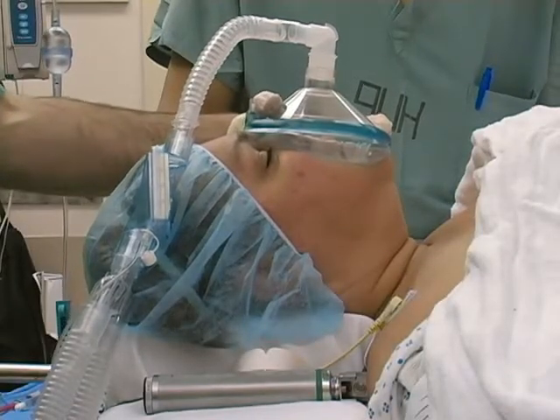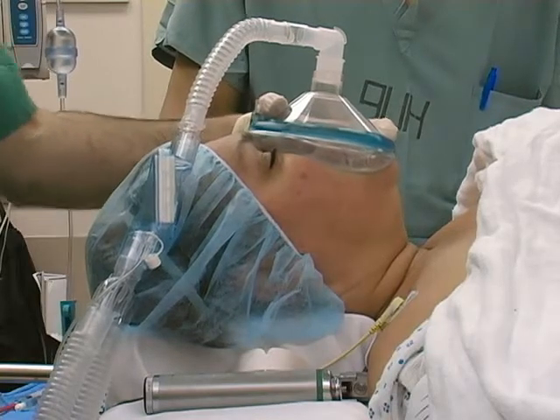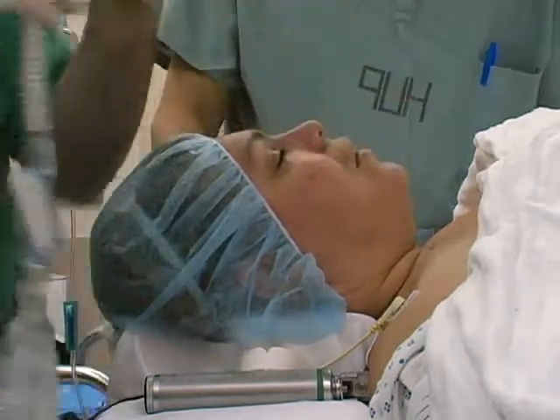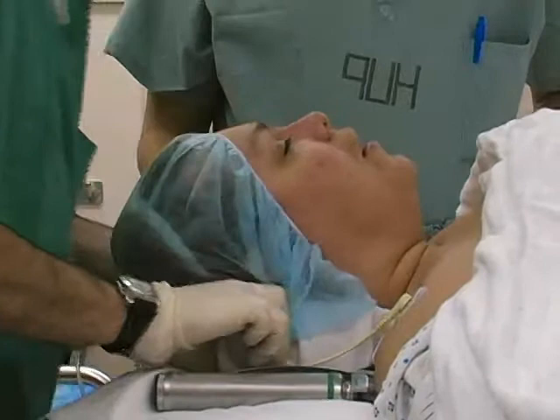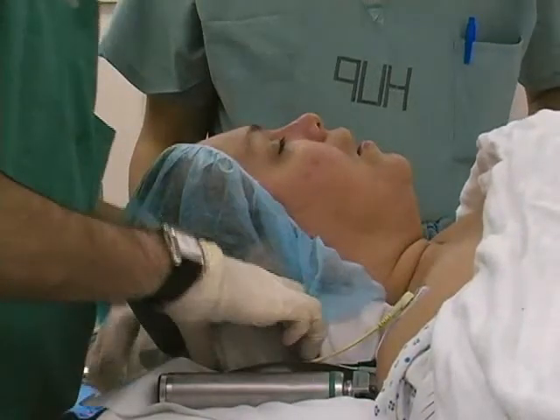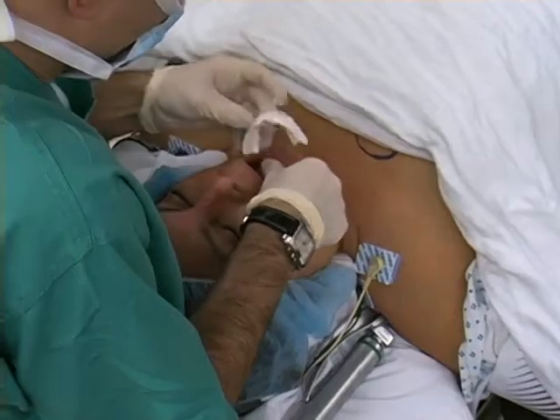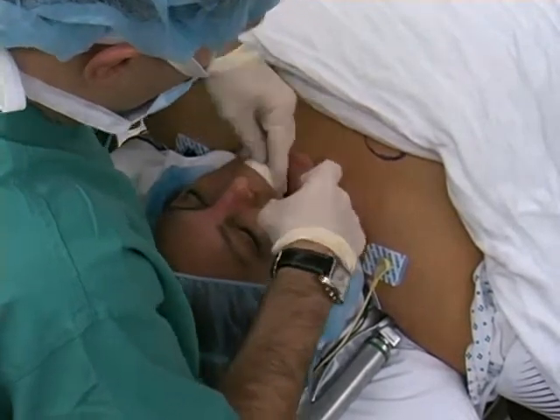Induction of anesthesia is initiated while the patient breathes 100% oxygen. After ensuring that the patient can be successfully ventilated using a mask, you may proceed with the laryngoscopy. The patient should be placed in a supine position with his or her head resting on a foam pillow. Raise the table such that the patient's oral aperture is level with the physician's xiphoid cartilage. To protect the patient's teeth, place a dental guard over the upper incisors.